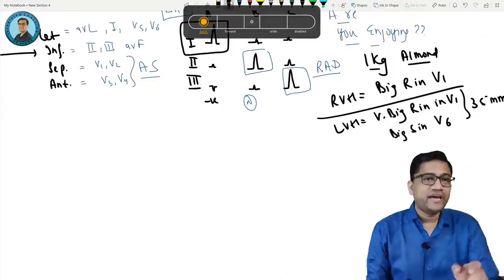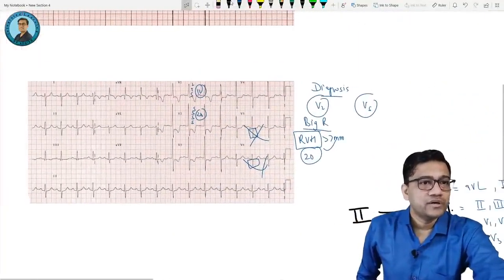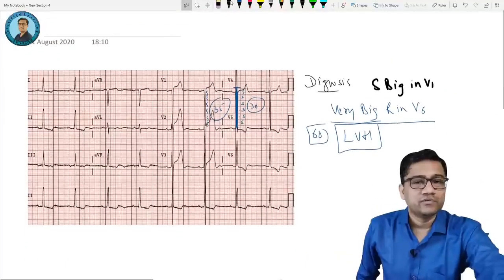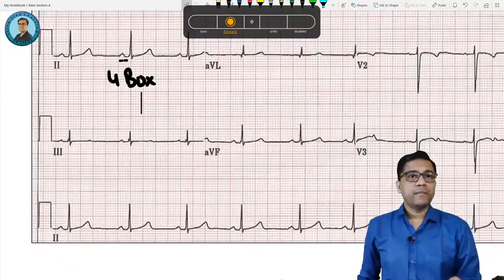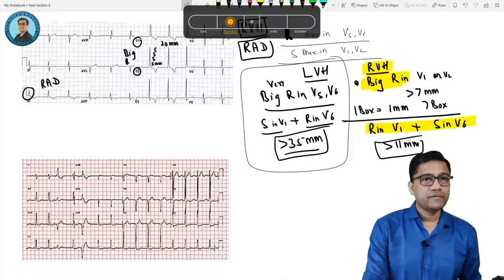Let's try to see if there are any good leads. I think there is a good wave here. No, let's go there. Okay. So clear. I'll try to find some good waves. Okay. Normal one.